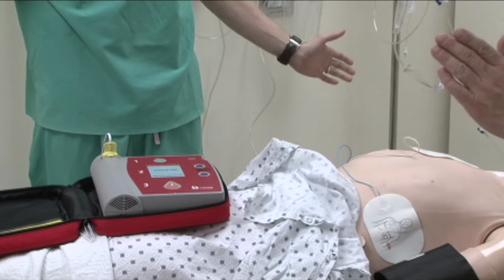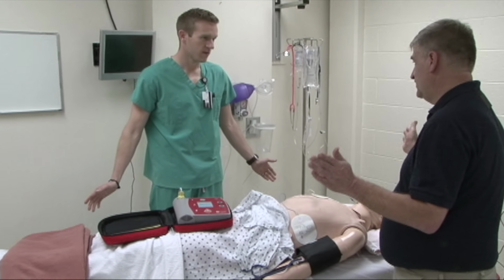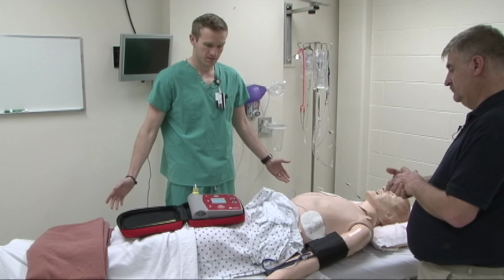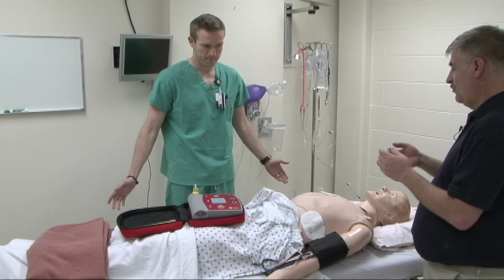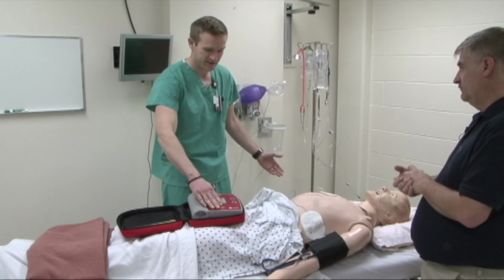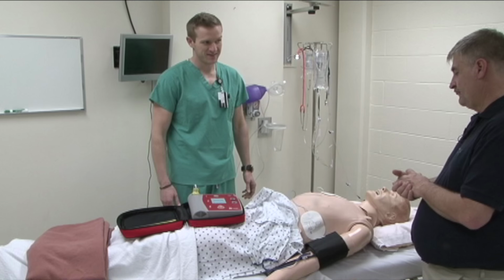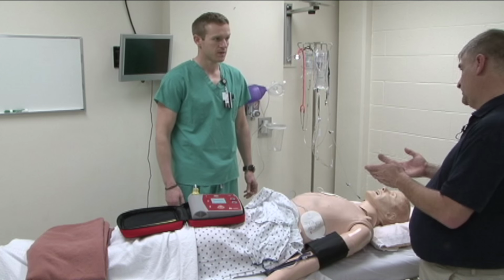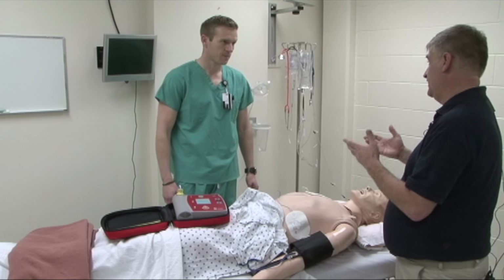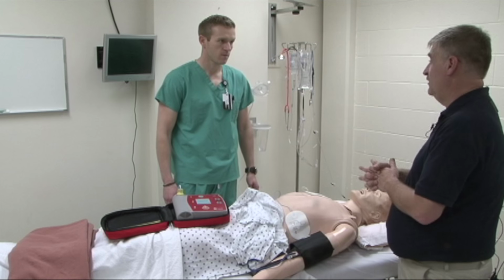Analyzing heart rhythm. Do not touch the patient. You may want to repeat, I'm clear, you're clear, no one's touching. Shock advised. Everyone's clear. Charging. Stay clear of patient. Deliver shock now. Press the orange button now. Everyone's clear. Shock delivered. Paused. Begin CPR. What you may see is the victim jolt for a second. That is an automatic response from the electricity being delivered to the victim. Don't be alarmed. Go ahead and start CPR once that happens.